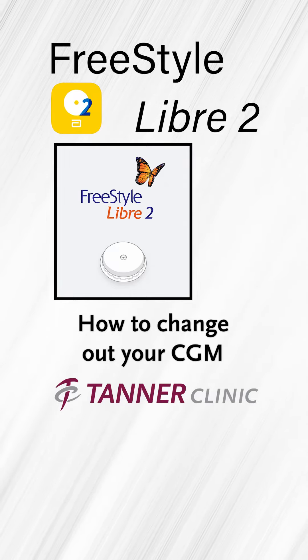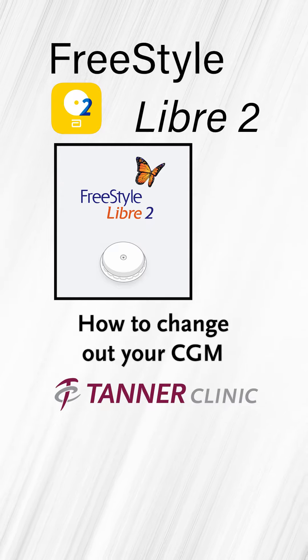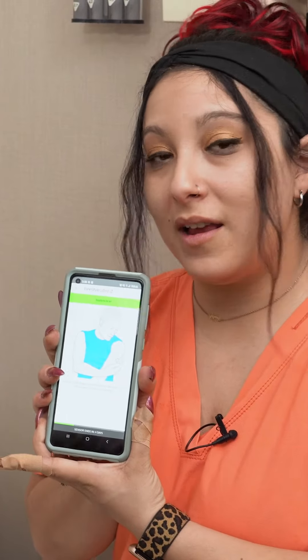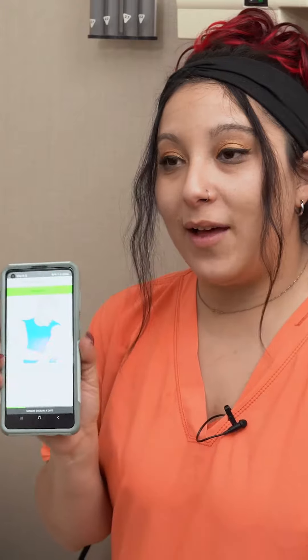Today we're going to be changing out the Freestyle Libre CGM, which is your continuous glucose monitor. Most Libre CGMs will either come on your phone on an app called the Freestyle Libre 2, which is available for Android and iOS.